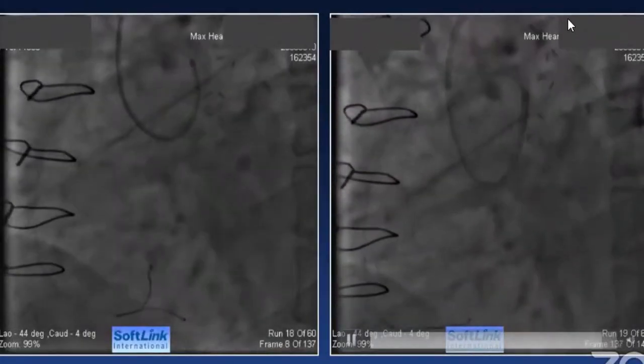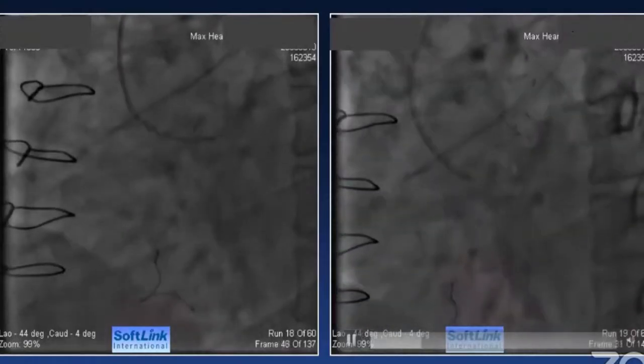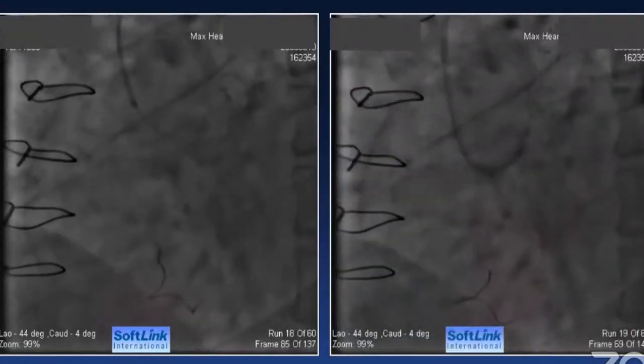Angelini is the one who's done a lot of work around imaging these arteries. I know that there are publications on flow measurements, but I can't recollect what the assumption was. And certainly it doesn't figure in any of the recommendations for evaluation of ischemia. But the physiology has been measured down these arteries by Angelini, and great intravascular ultrasound images, as well as physiological measurements have happened very recently. And he's done the most work on this.